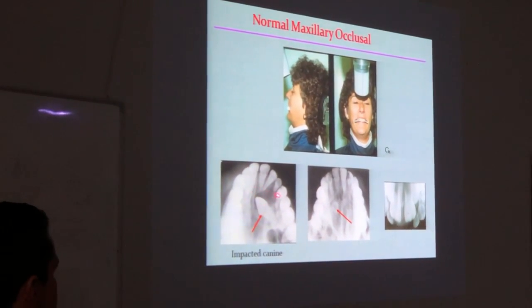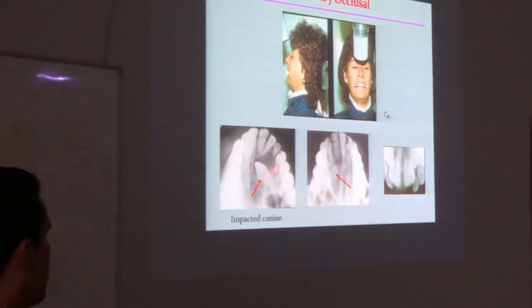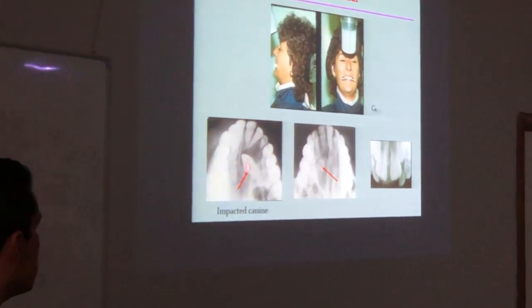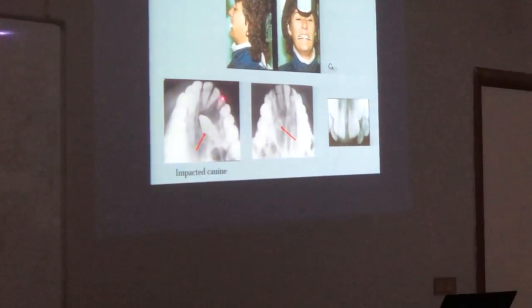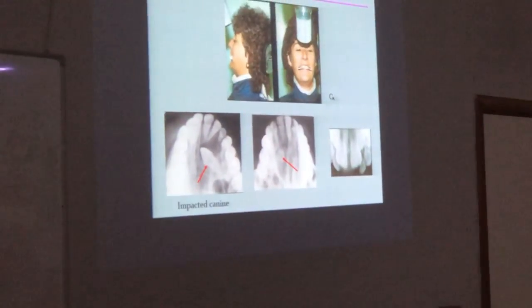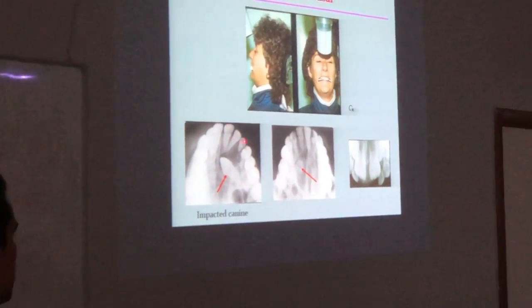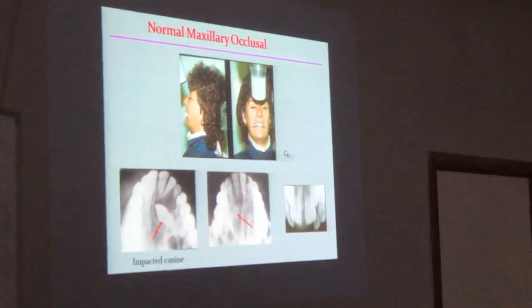You see it making resorption to the palatal bone, affecting the central, the lateral, and what is this tooth? بالضبط. C. Because it's impacted, so it's not shed. So this is 1, 2, this is C, 4, 5, 6, and this is 7. Okay. What about this?